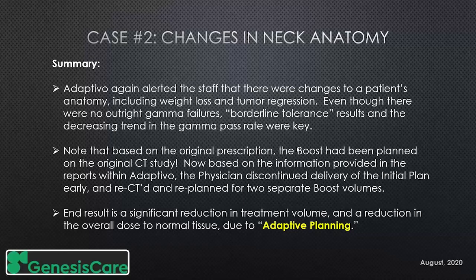Apparently, and I wasn't the person who chose the 80% gamma tolerance, by the way, I'll read the question. It says, is there any particular reason to choose 80% gamma tolerance? I was told that this was based on a European study that found that 80% threshold on the initial pass was a good pass criteria to use. And that is why our company has chosen to go with the 80%.